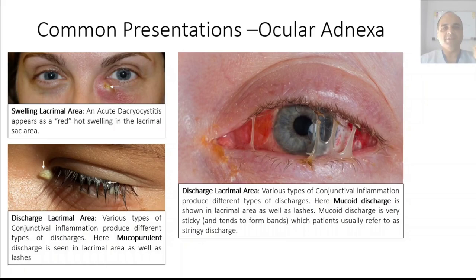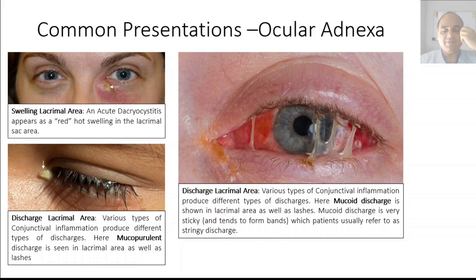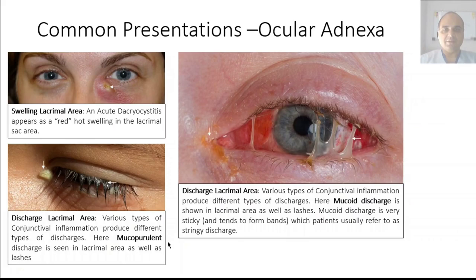Compare that to a mucoid discharge, which is more white in color compared to a purulent or mucopurulent discharge with a yellowish tint. Mucoid discharge forms bands because mucus is very viscous — you can see bands between the upper and lower lid and accumulating in the medial canthal area. Mucoid discharge is seen in allergic reactions. Patients describe it as a stringy discharge, or in Urdu as a spider web forming in front of the eyes.